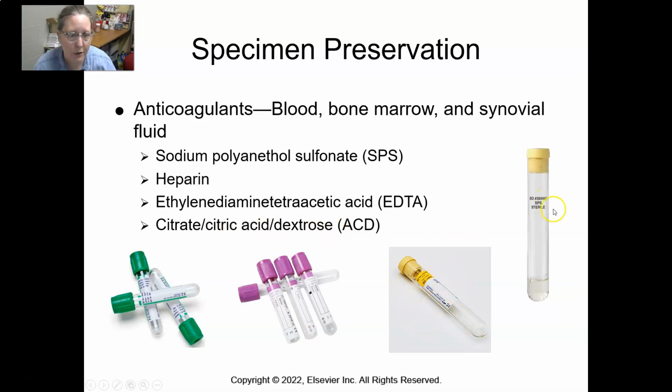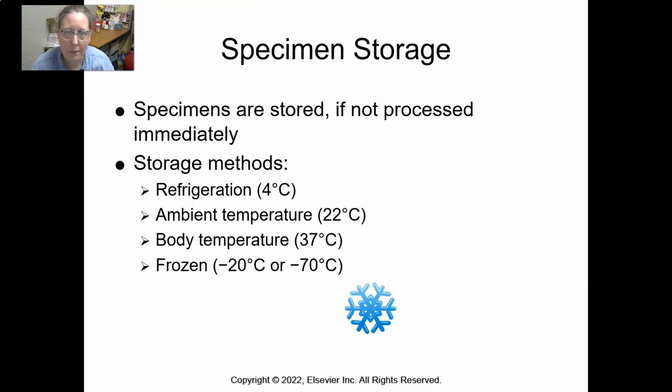So be careful to not confuse these two. They're not the same, and really check your specimen requirements if you're collecting these for a send out of some sort. And yes, these tubes are sterile unless you open them, and of course once you open them they're not, but the inside of the tubes is sterile.